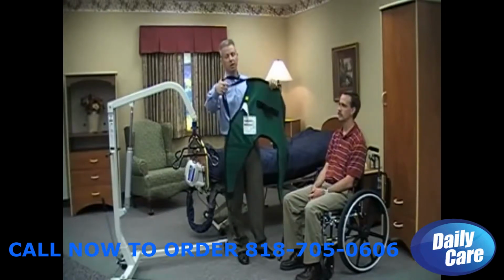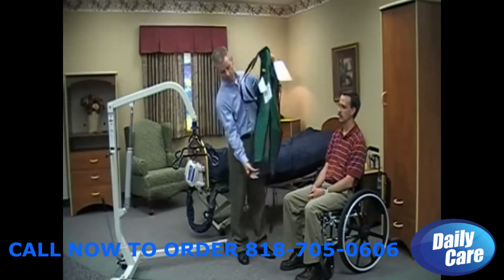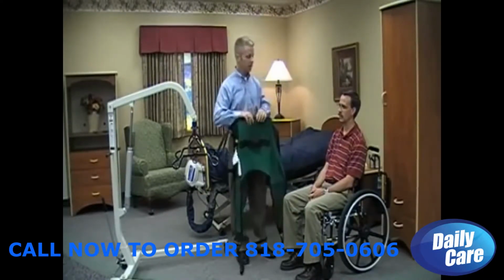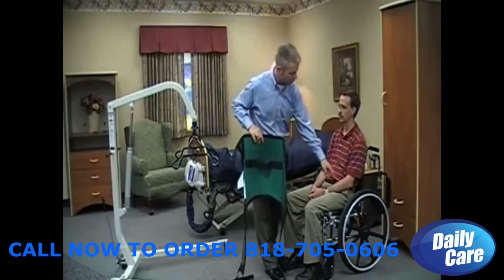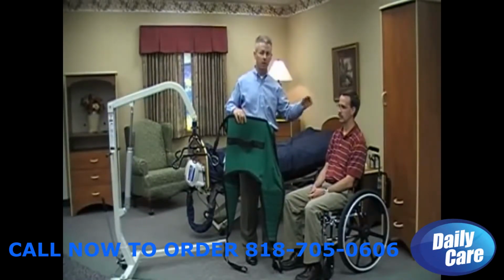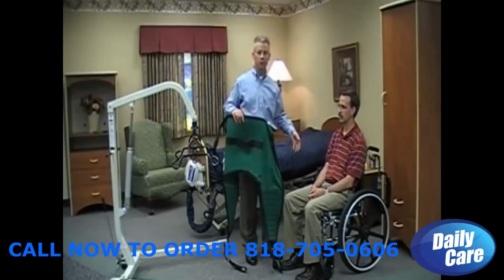Each of the slings also has four straps. And as I go through the process, I'll describe them. But there are straps on both sides for the shoulders as well as both legs. Now for convenience, I've removed one of the arms of the wheelchair so that it'll make it easier for you to see me fitting the sling appropriately. But in most cases, you'll have an arm on both sides of the wheelchair.